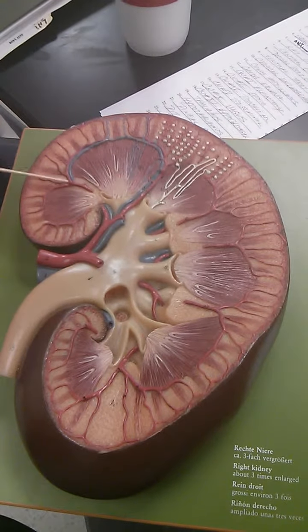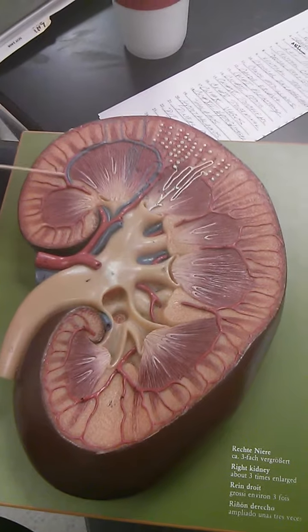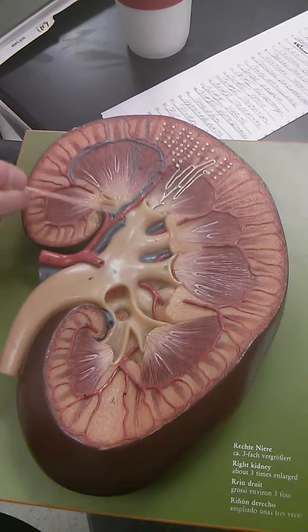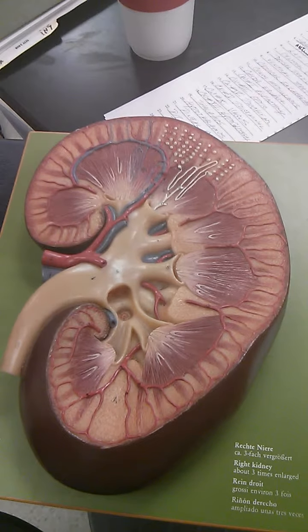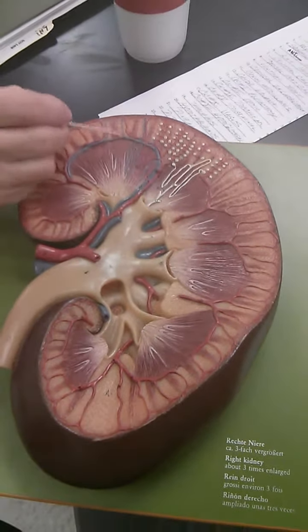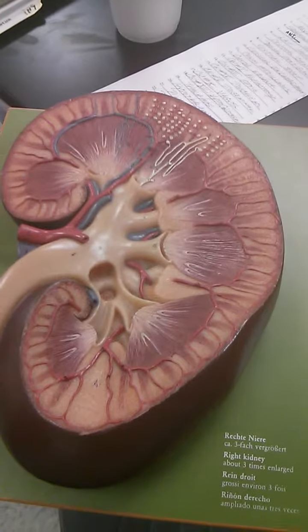Cortical radiant artery comes up on this side, terminates, and then comes back down this way. It goes up this side, terminates, and then comes back down this way. So it's the only place that we find that type of circulation where it goes up but doesn't connect, and then it returns down this way. So there's that little space right there that there's no connection, which is kind of interesting.